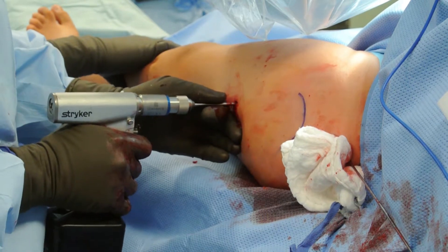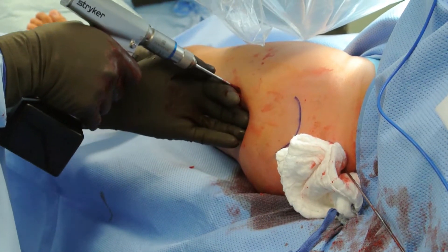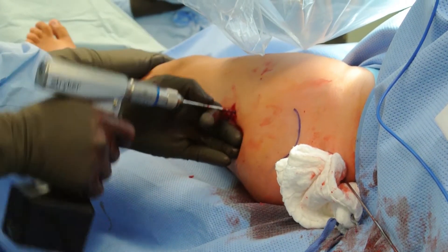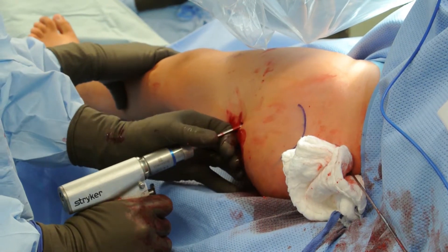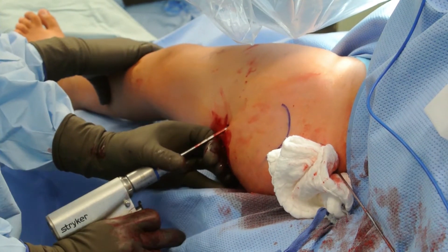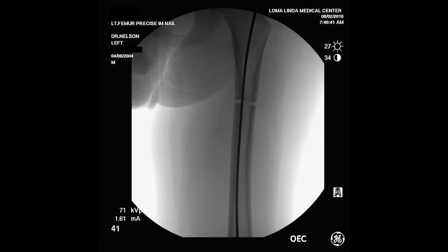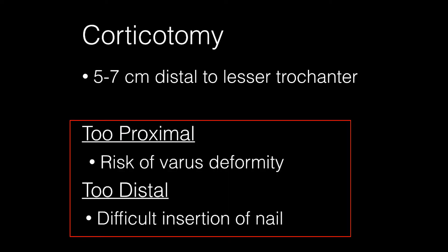A 3.5 to 4 mm drill bit is then used to percutaneously perforate the femur at the planned level of corticotomy. I typically place at least one perforation in the lateral cortex and three in the medial cortex. This decompresses the femoral canal during reaming and prevents fat embolism. Also, these perforations provide an exit site for the reamings, which essentially fertilize the corticotomy, leaving a very satisfying cloud of reaming material which can be seen even on x-ray. This is usually done 5 to 7 cm distal to the lesser trochanter, but may be influenced by sagittal or coronal plane deformity.